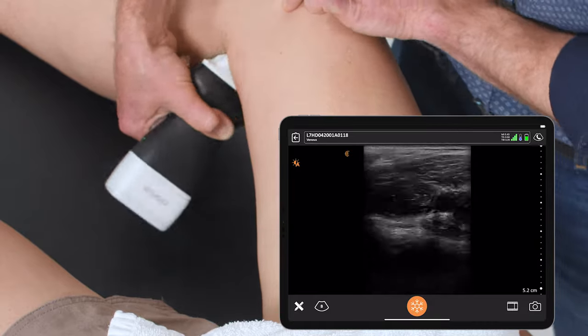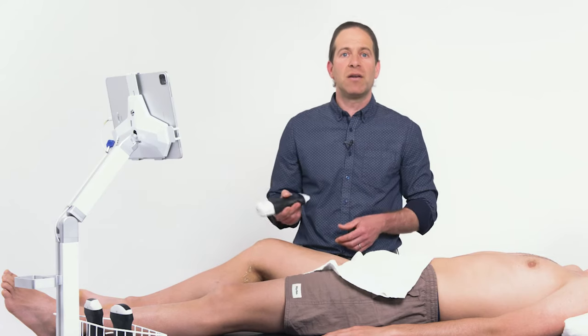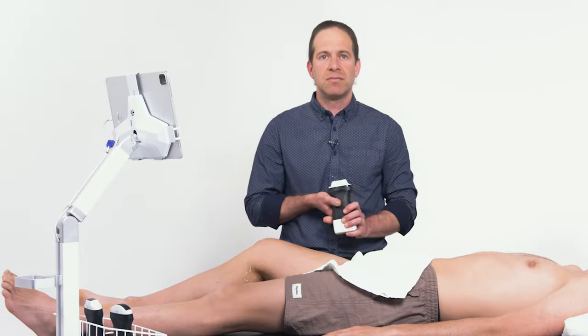Once I've accomplished that all the way down the leg, I can feel confident that there's no deep venous thrombosis.